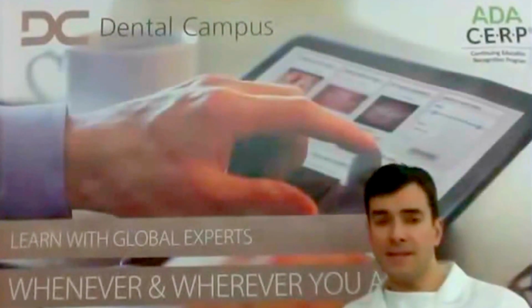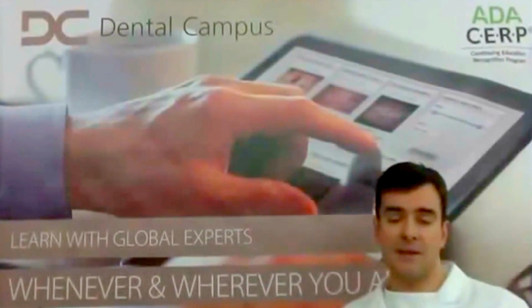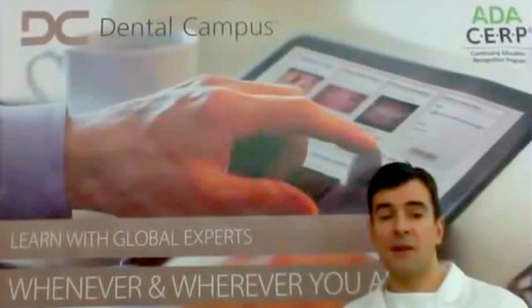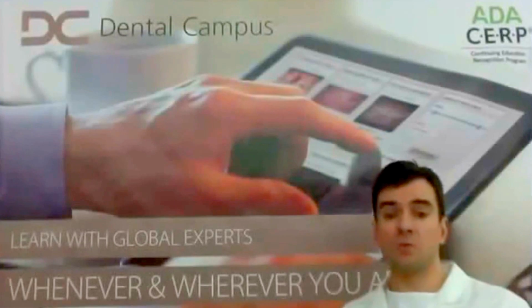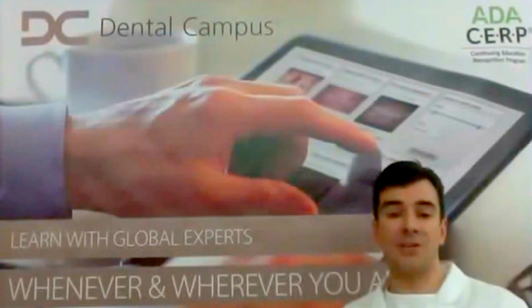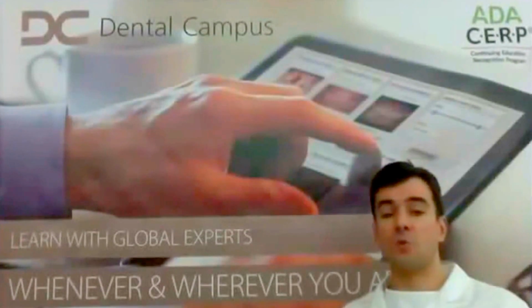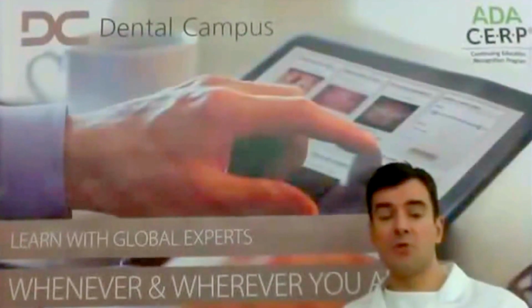But in cases in which, so the typical case in the aesthetic situation in which we choose to go for submucosal healing and so on, it takes more time for the healing. In that case, we need some kind of maybe not implant-supported reconstruction. So there are two removable possibilities. I would say for clinicians, for us, it's much more efficient and predictable to use removable appliances.